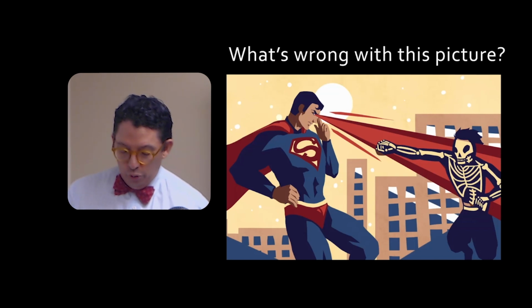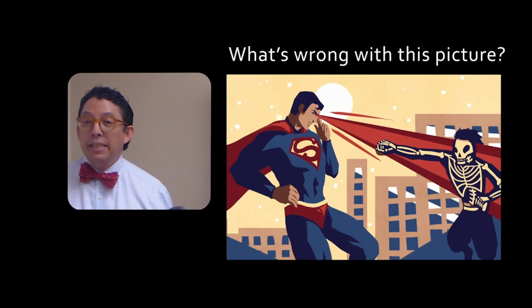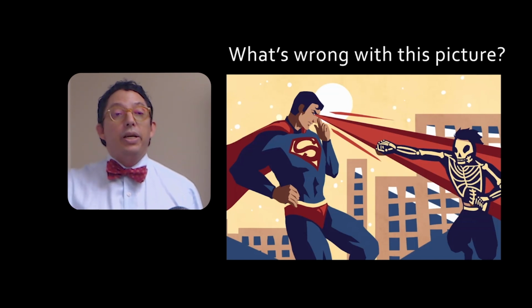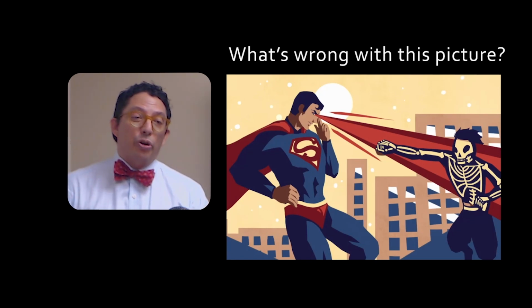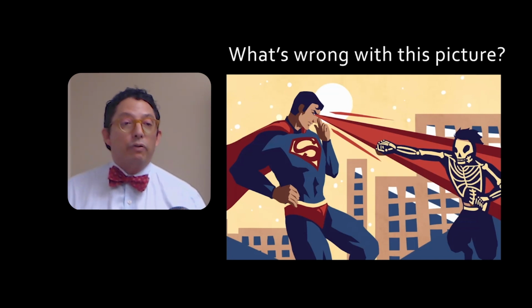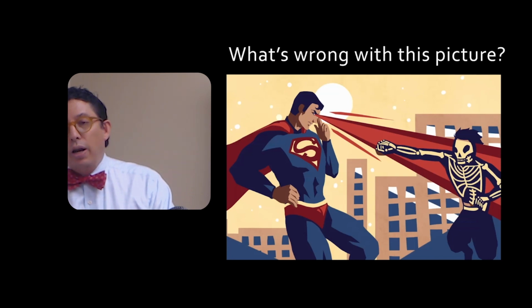So we are all used to looking at x-rays or photons in a different way. Typically, you have seen them when they show you guys in the movies, or you see people looking at them through an acetate, which is a piece of plastic, and you put it on a view box, and then the view box would show us a grayscale of something inside of a body that the x-rays had crossed through. Now we don't do that anymore. You guys see PACS and you see images in computers that can show you exactly the same, because we have changed this analog way of doing images to a more modern way of doing images, which is using electronics.